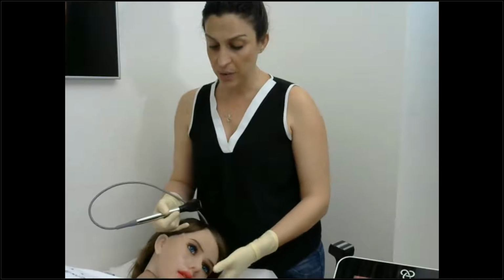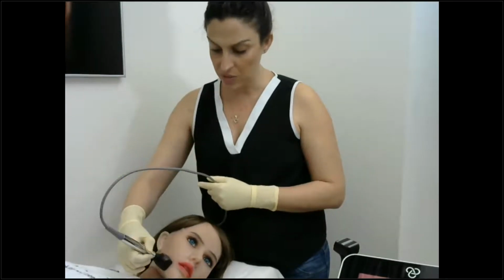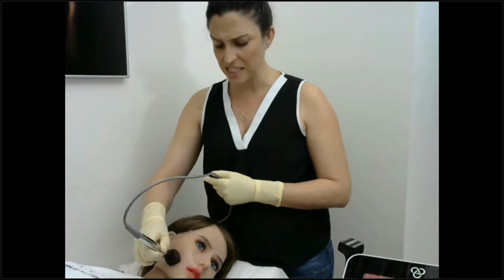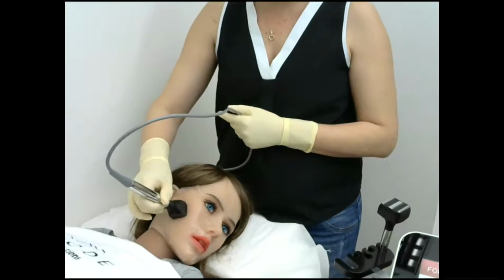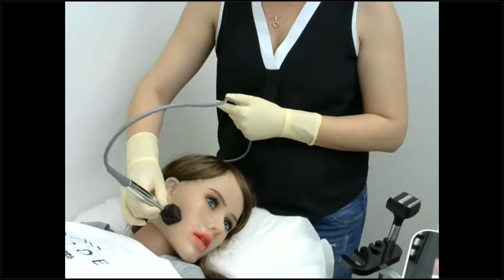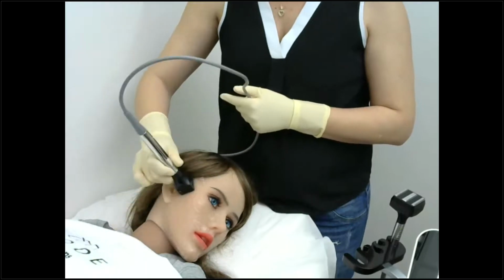You've asked if there's a specific way to be moving about the treatment area. Generally, I want it to be comfortable for the patient. Normally, at the beginning of the treatment, I move slower because I want to heat up the tissue faster. I want to focus on areas more deeply in order to increase the skin temperature faster. But once I'm there, then I can start moving slightly faster, and it's nicer for my patient and for me.